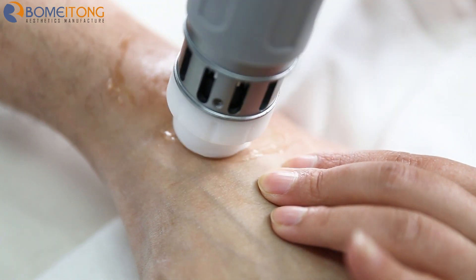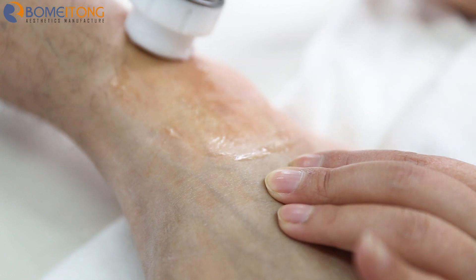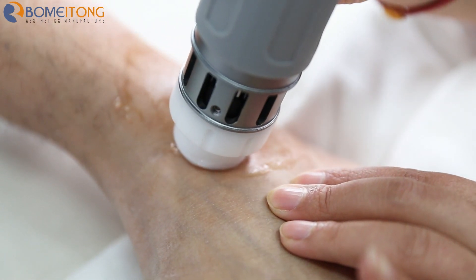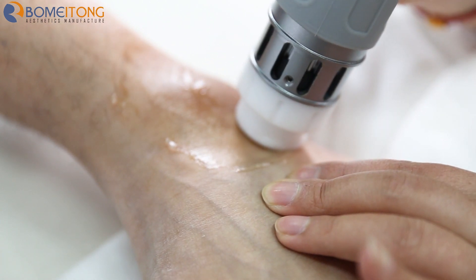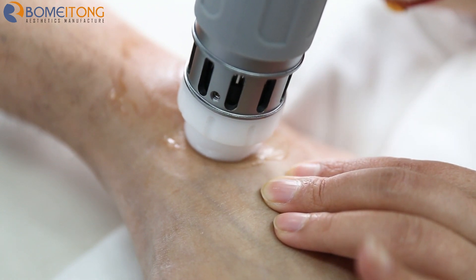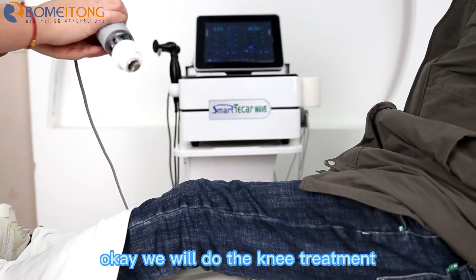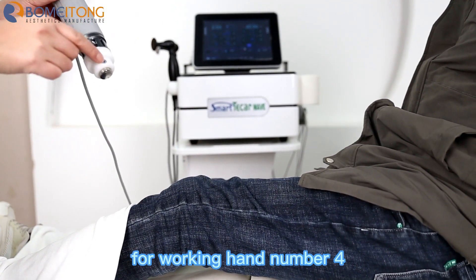This is the upper ankle — click start and start the ankle treatment. Now we will do the knee treatment, and we use the four working hands, number four.